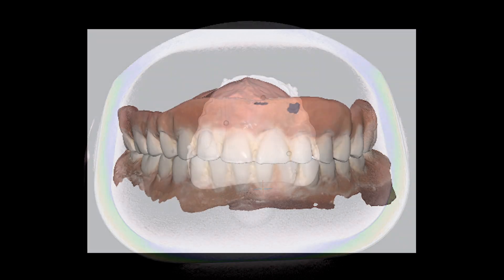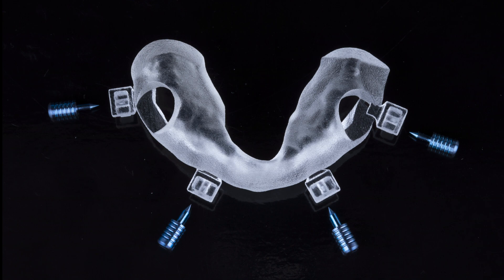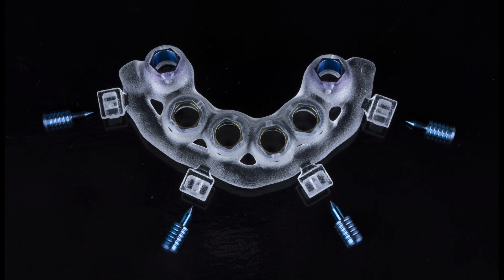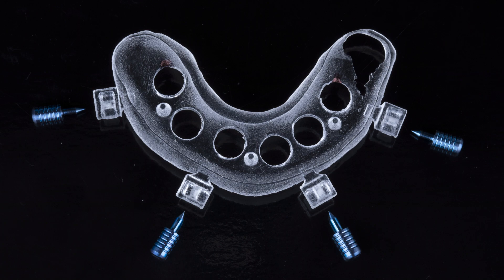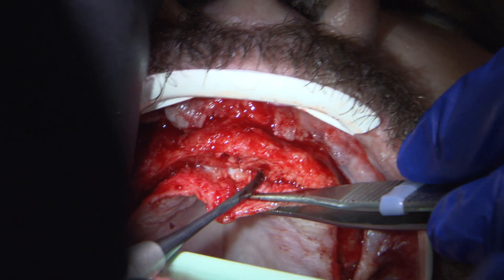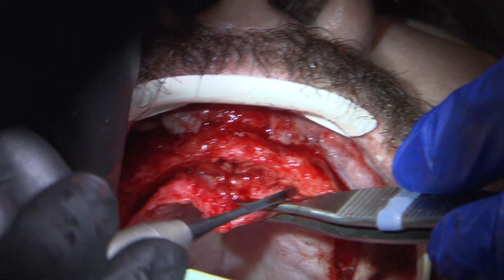Additionally, scans of the dentures utilizing the Medit i700 wireless were acquired to aid in the fabrication of the immediate load provisional. This multilevel surgical guide is designed to sit directly on the bone. Therefore, a full thickness flap was reflected, extending the flap to ensure the guide fully seats on the bone and no tissue interferes.